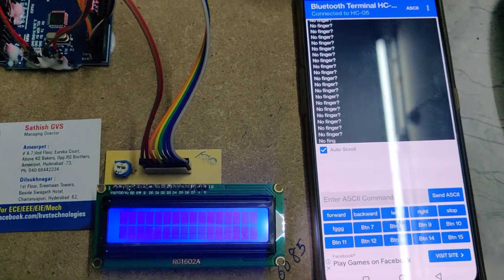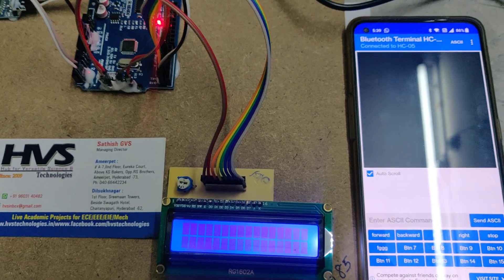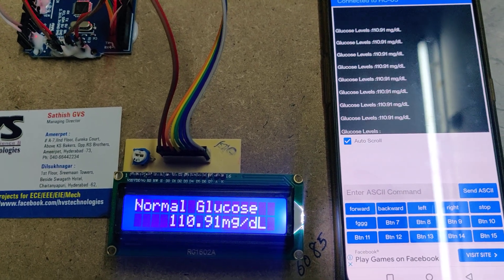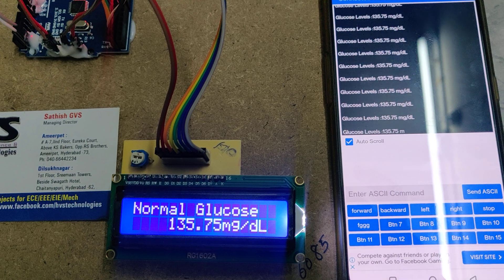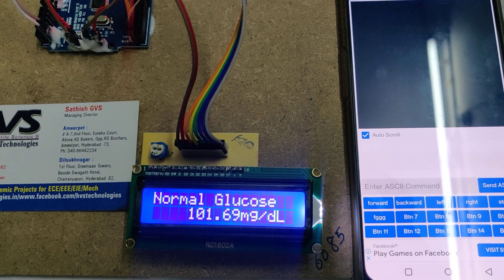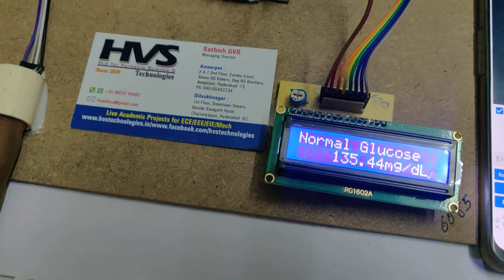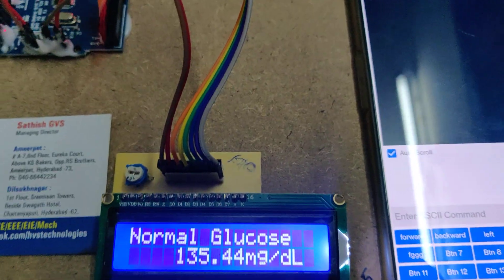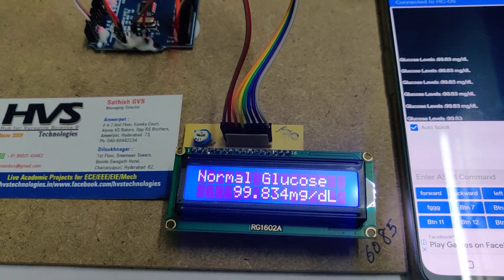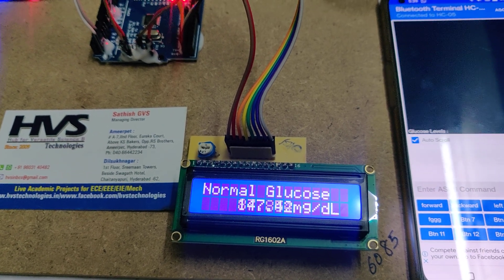Once connected, you can see the device is connected. With no finger placed, once you place the finger, don't move it while getting readings. Place it calmly and wait for some time — the readings will be displayed continuously. If you move the finger the readings fluctuate. Keep it still without any movement and the readings will normalize. Just place it gently on the sensor — don't push hard.